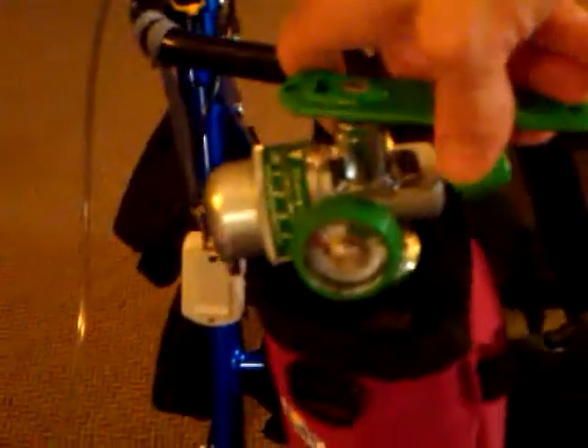And what I'm going to do is open up the bottle. You open it one turn — all you do is one turn. Here we go, one turn.